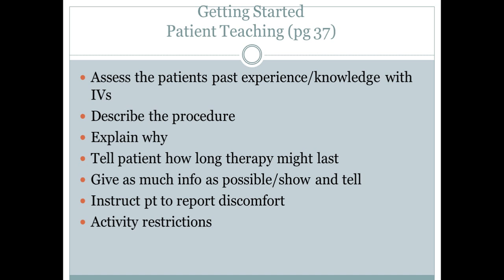I'm going to let the patient know, let's say they're in for dehydration, and say, Dr. So-and-so had ordered you to have some IV fluids, and he wants you to have some normal saline. And I might talk to him about it's just basically like salt water, and the way that we want to get this fluid to you, since you haven't been able to drink, is through vein access. And then I might draw a picture. I might show them exactly what's going to happen.